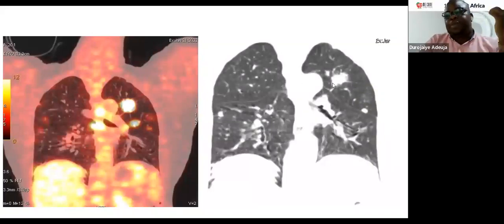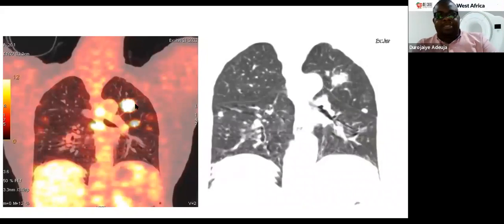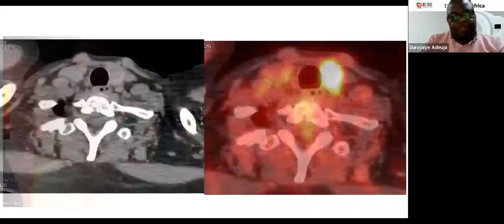Sometimes, if the patient has undergone chemotherapy, radiotherapy, some of them might become inactive or less active, and the degree of enhancement will begin to reduce, and the nuclear physicians begin to look at the SUV values and the tumor to blood pool or tumor to liver ratios, in being more specific or more circumspect about the degree of activity or inactivity, as it were.